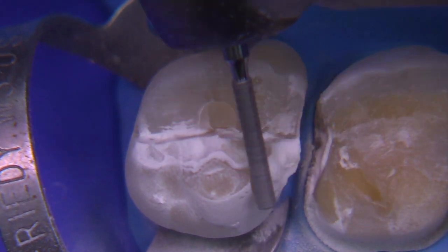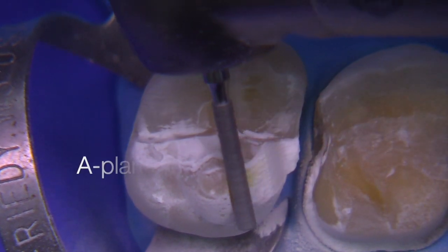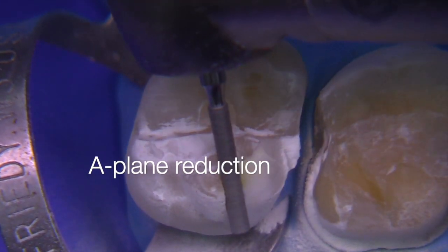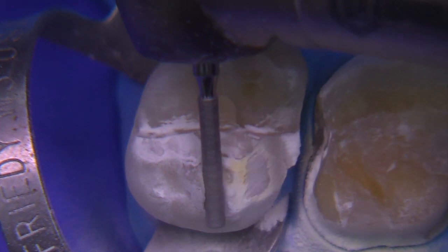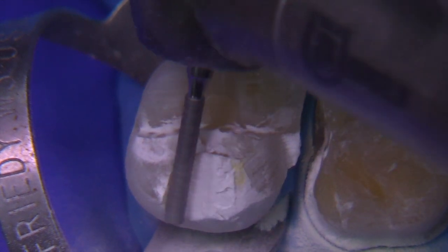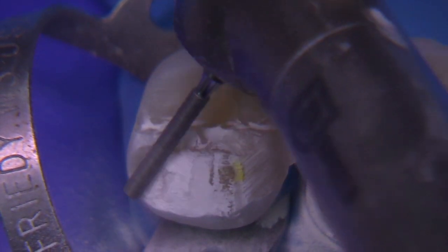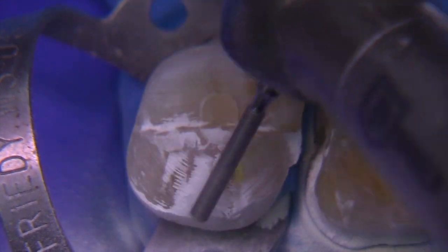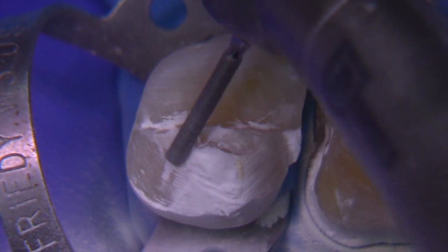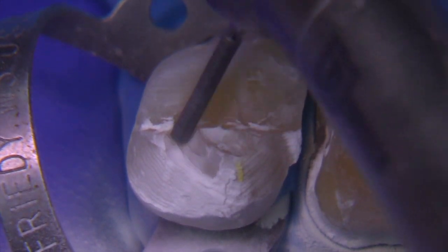E.max can be used in a more conservative manner if you have nothing but enamel on the occlusal surface. Then you can bond it like a veneer in cases where maybe you're opening up vertical dimension and you want to have a significant amount of bonded ceramics on top of that. But for the most part for crowns, we are removing the lion's share of the enamel and we want to have 1.5 to 2 millimeters for lithium disilicate.